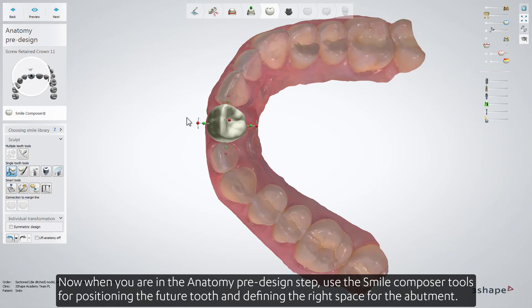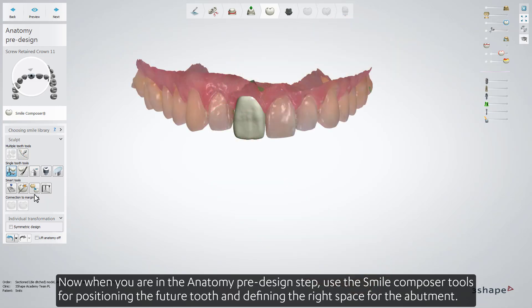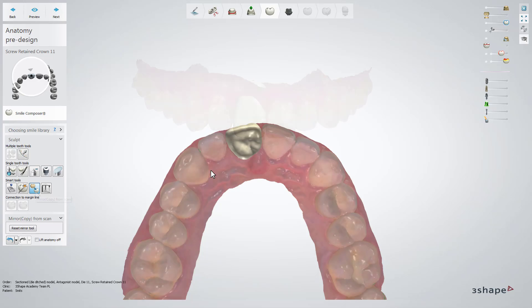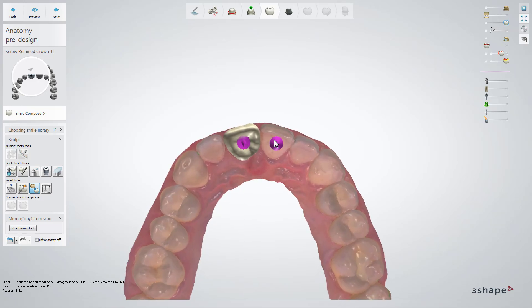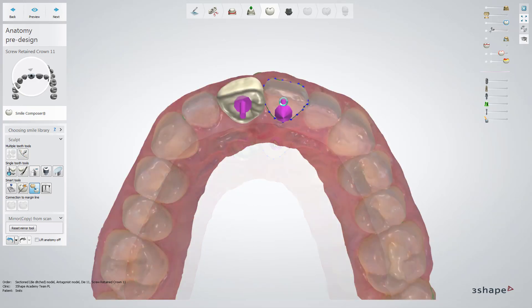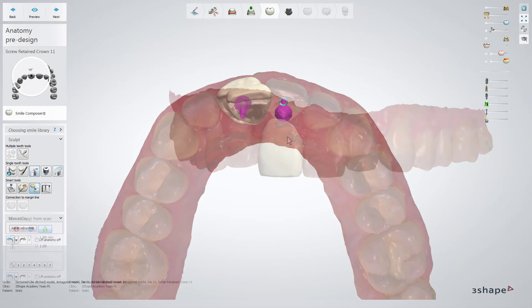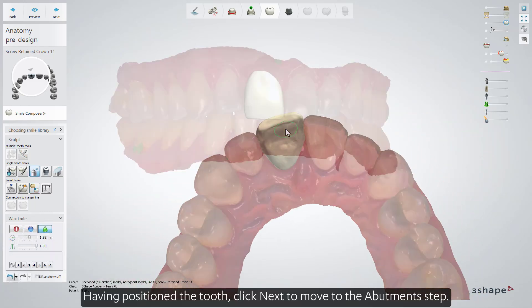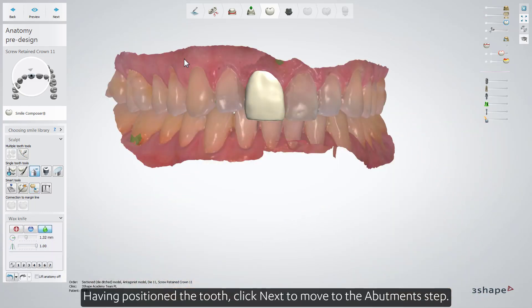Now, when you're in the anatomy pre-design step, use the Smile Composer tools for positioning the future tooth and defining the right space for the abutment. Having positioned the tooth, click Next to move to the abutment step.